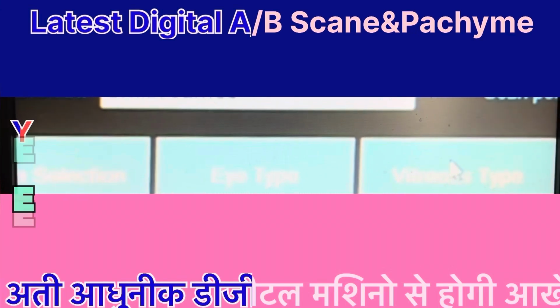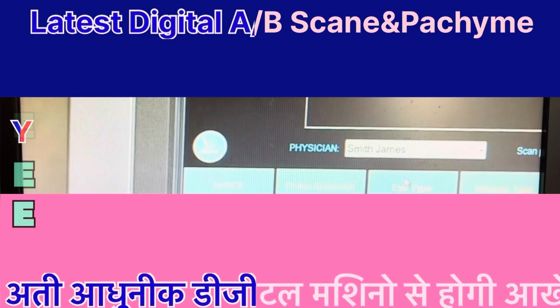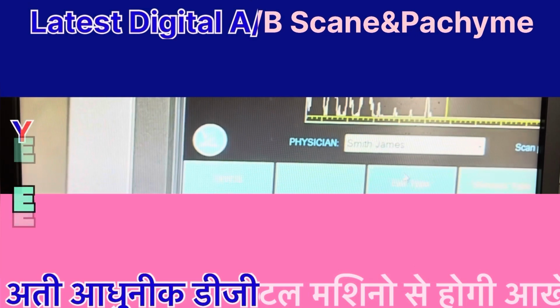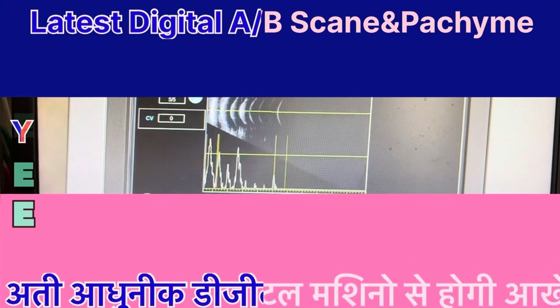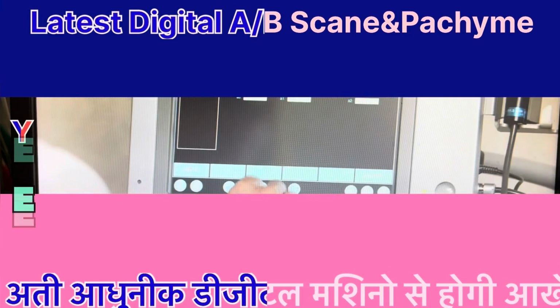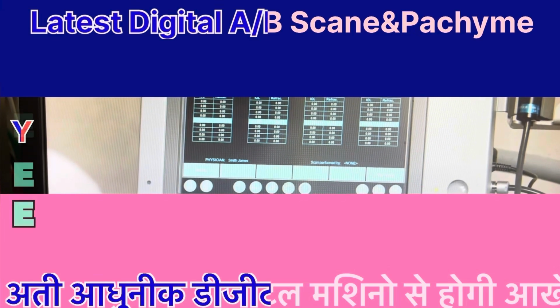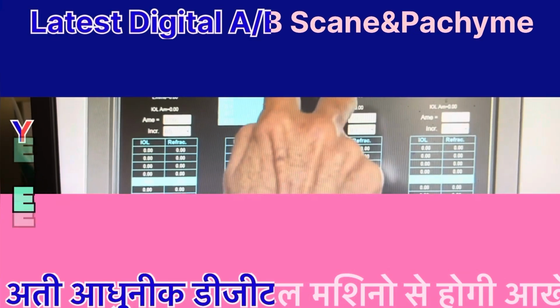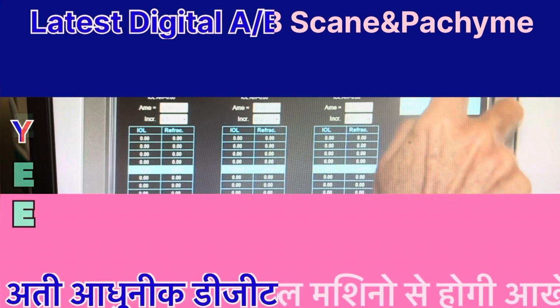The examiner can then select the eye, OD or OS, the probe, bio, probeam, or B10, eye type, phakic, aphakic, or pseudophakic with relevant IOL material, and vitreous type, normal or silicone oil, via corresponding function buttons on the toolbar. After finishing the setup, the probe can be activated by using the foot pedal or pressing the foot switch icon to begin scanning. During acquisition, the examination screen will display scan images and results of measurements side by side.